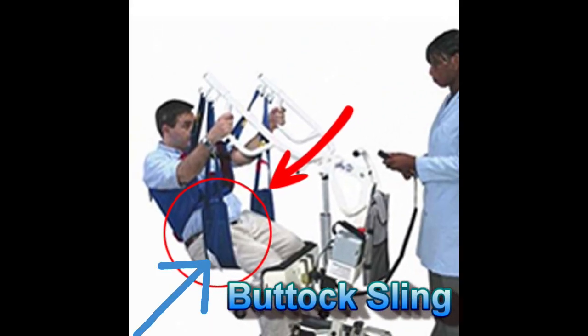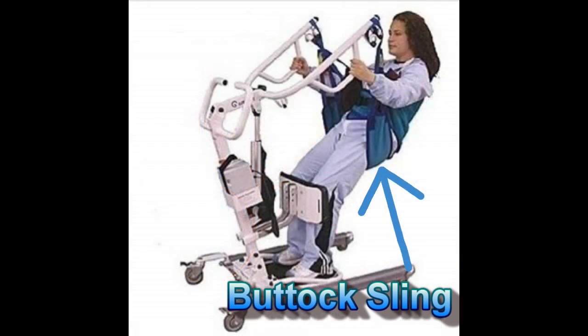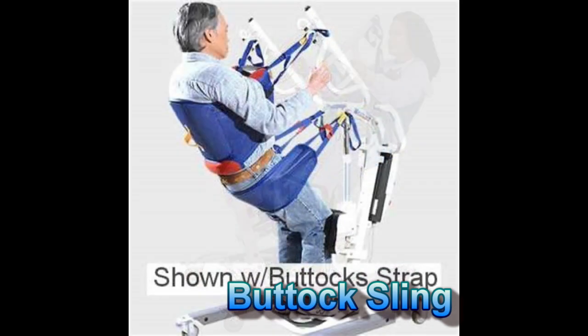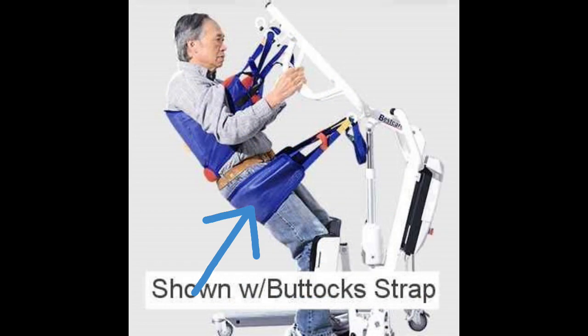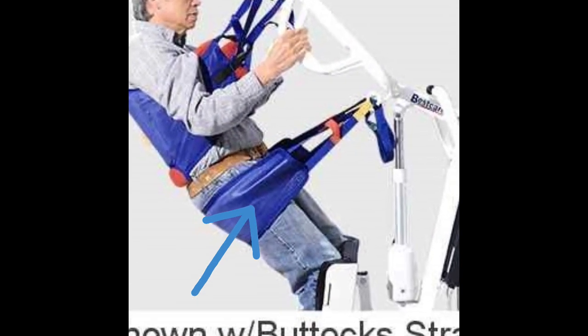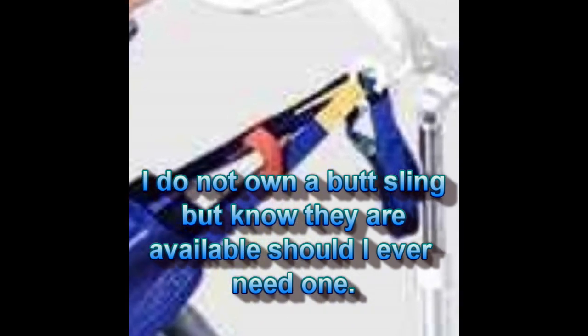Are you aware that a butt sling can be used in conjunction with a standard lift sling? This may be an option for anyone who just doesn't feel comfortable being lifted to a standing position only using a standard sling. The butt sling can be attached to a third set of hooks towards the front of the lift arm or to the unused hooks on the lift arm.